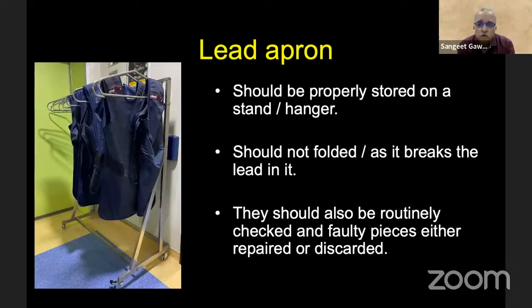And the way you store the apron is also very important. They should be stored on a stand or a hanger like this. They should never be folded, as folding the lead apron will break the lead inside it, and you will not know whether the lead has broken inside and your gonads are directly exposed. You feel you are wearing an apron, but there is no lead inside that apron. It has settled in the bottom because of gravity, because of the breakage, because of the repeated folding of the apron.